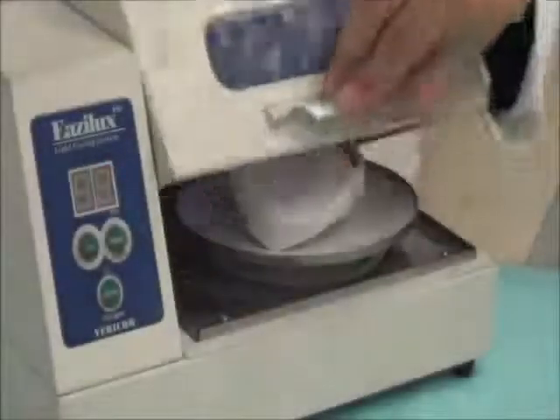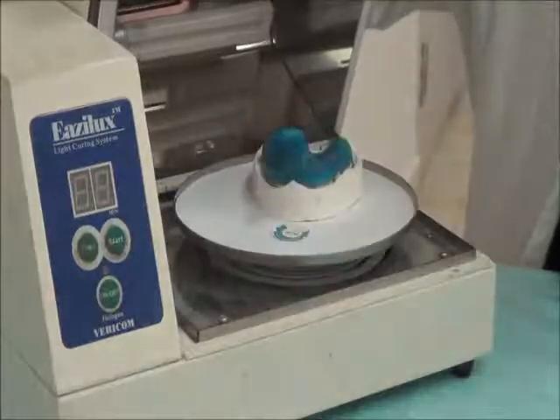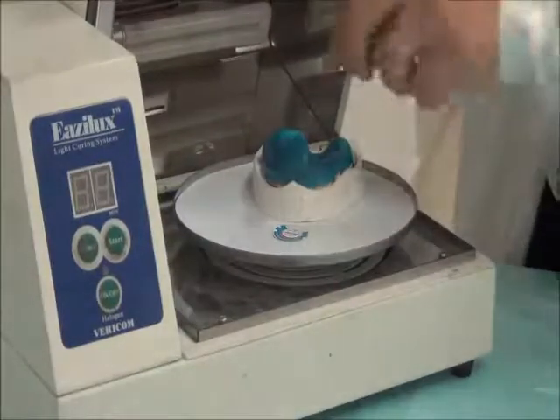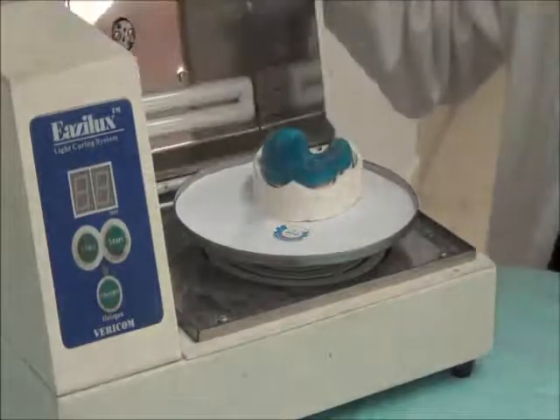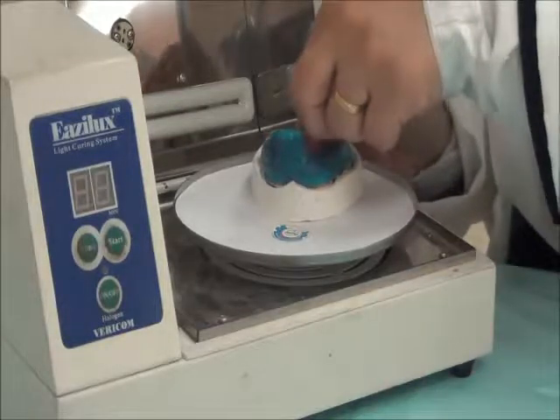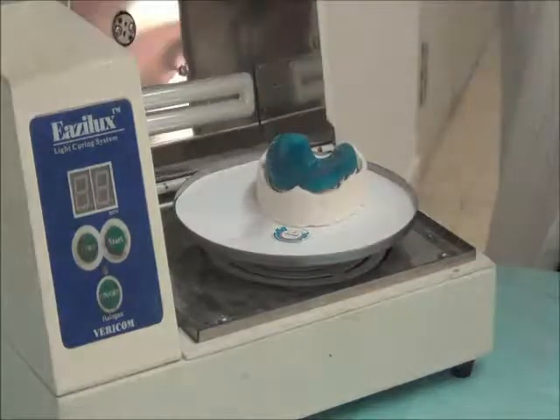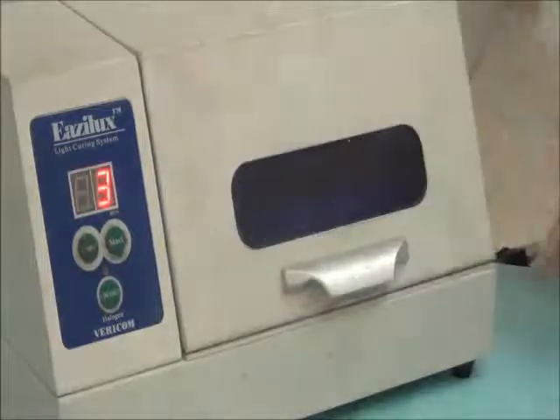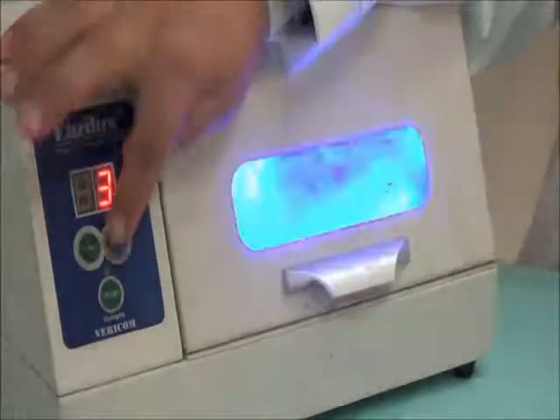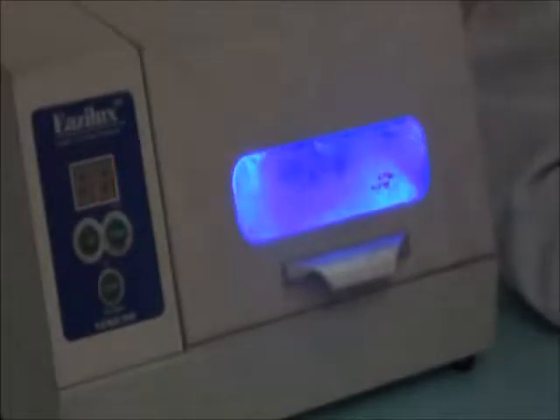In the middle of the cycle, I could open this and remove the support I was placing, because the support will be preventing the light from reaching some parts of the cast. As well, I'm removing the opaque layer that I placed on the palatal side to expose those areas now, and it could continue its cycle. We're going to wait for the 3 minutes to finish, then open it, take out the tray and the cast, separate them, and put the tray alone for the fitting step.